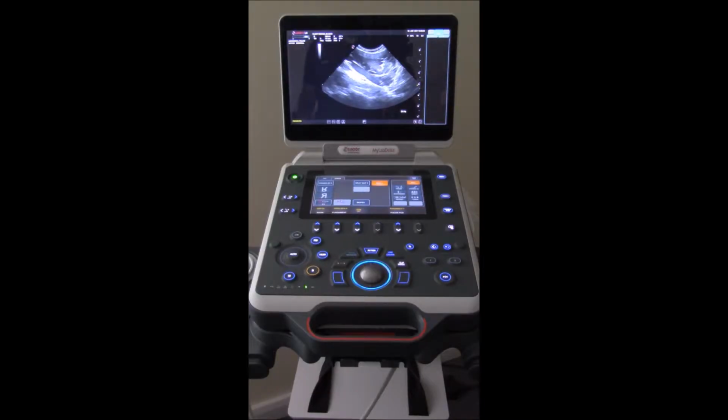We're now going to talk through the 5 basic controls that you should be using when you're scanning to help optimise your image. The first one we're going to choose is the depth. So we can see on the side of the screen here that we've got 0 to 6 centimetres, and also shown at the top up here you can see we've actually got D, and it's actually at 54 millimetres.